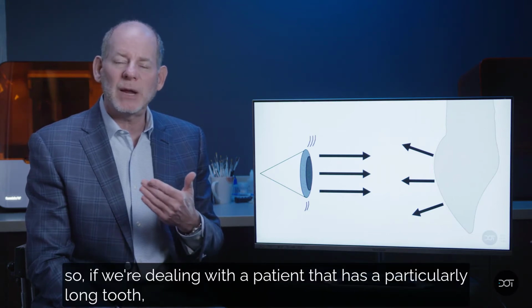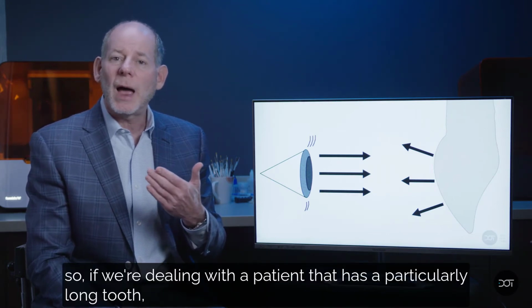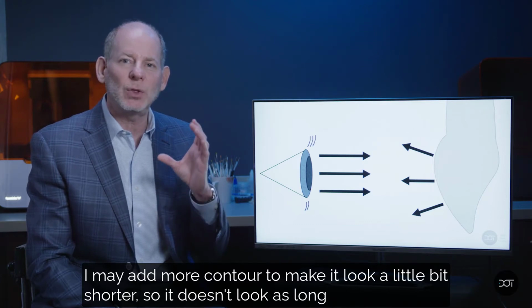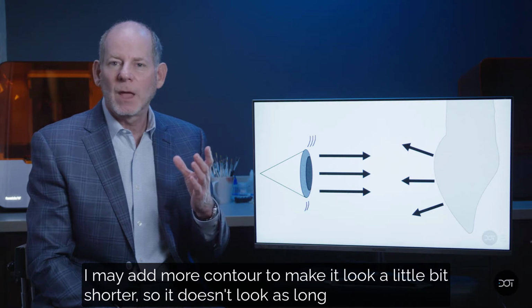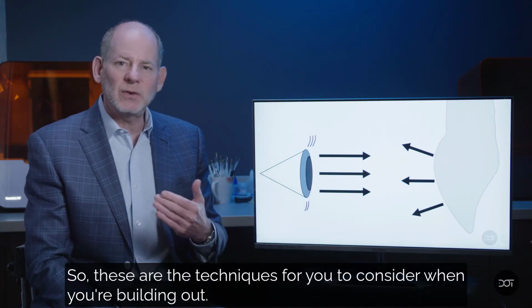So if we're dealing with a patient that has a particularly long tooth, I may add more contour to make it look a little bit shorter so it doesn't look as long. So these are techniques for you to consider when you're building out.